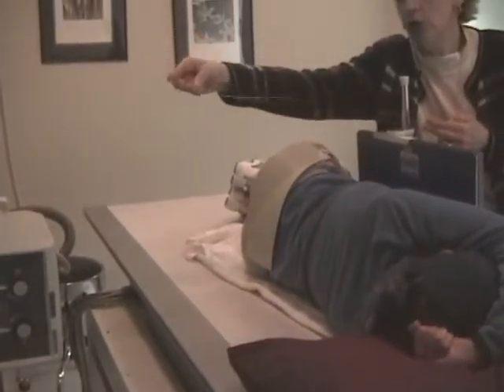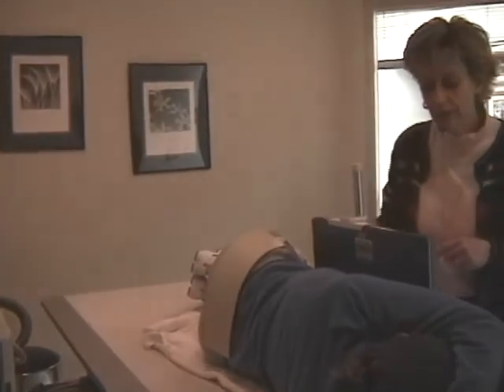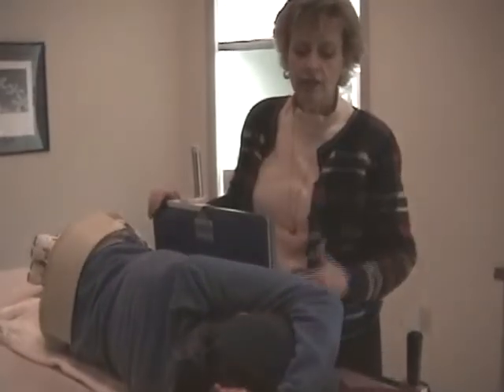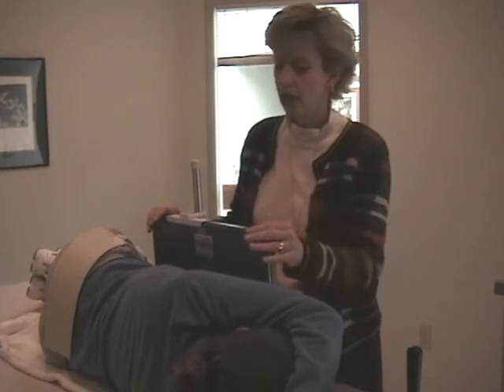You can see that the tube is shooting horizontally across the table. I have my 40 inches of SID. We've shown you this before when we've done the abdomen series. You measure a third of the way into the tube housing to get 40 over here to the grid. I have a 14 by 17 cassette with a portable grid face. And in this setup, the patient identification blocker is superior, and it actually ends up being closer to the table, but we want it above the apices of the lungs.